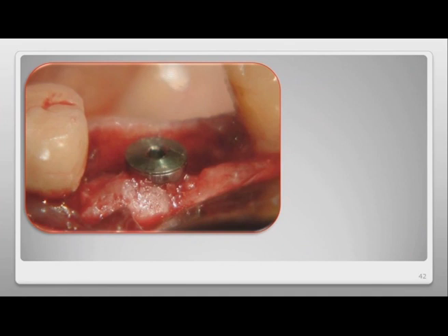Very simply, when we proceeded with the trephination of the opening to insert the implant, although this is subjective, on preparing the site to position the implant, we met with a hardness that was hardly any different from that which we can encounter in healed bone. I stress that this is a clinical judgment, but the implant meets the most basic requirement for inserting implants, which is primary stability, the physical stability that gets this implant started.